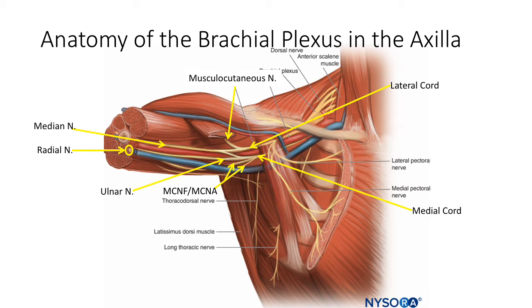The ulnar nerve is what remains of the medial cord after those other branches have left. The radial nerve is seen here too, but only in cross-section and at the most distal aspect, and that's because, like the posterior cord from whence it came, it is posterior to the artery. Lastly, here's the line demarcating the level at which the block will be performed. So, let's take a look at the cross-sectional and ultrasound anatomy at that level.